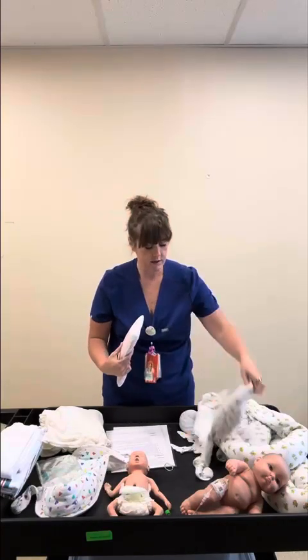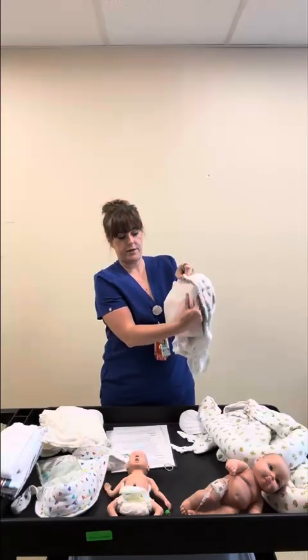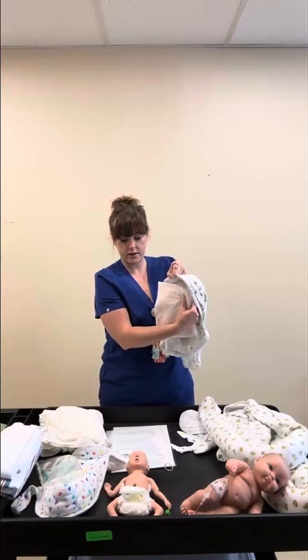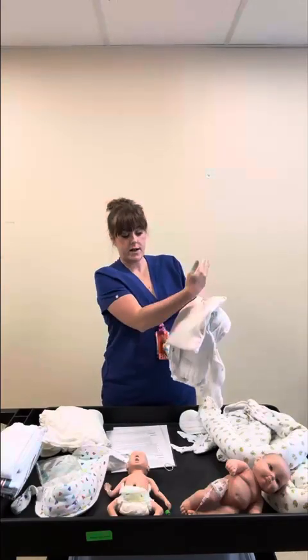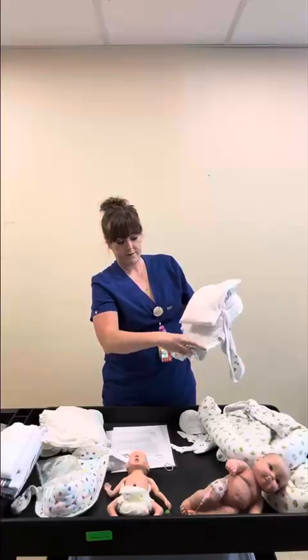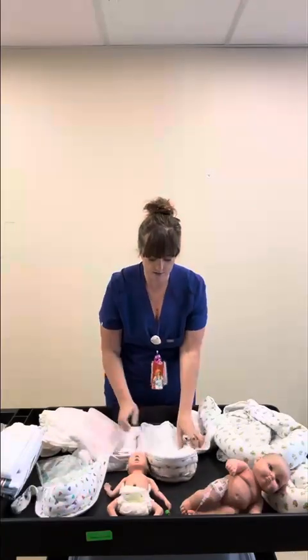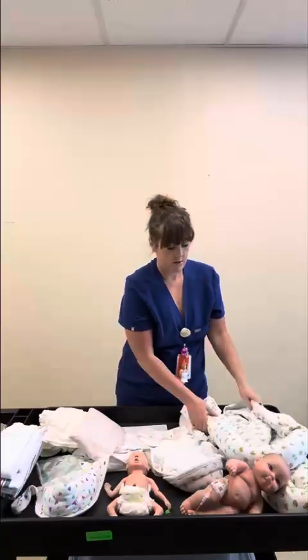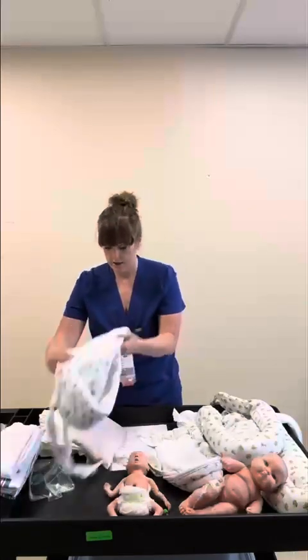If you're using the RU2, that can become tricky because you're kind of stuck with this abutting against this and you don't have a lot of runway. So you can either fold that down and that way you have a ton of runway and that way your baby's legs can fit, or you can use it the opposite way, like we described in the other scenario where this is the foot part, and that way you have a lot of runway here. You can create something with this, you can create something with this, you can get creative.